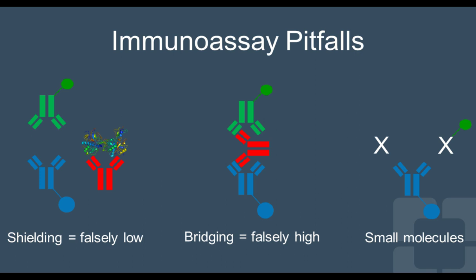Some of the pitfalls for this is that since it only has one epitope recognition site, the specificity of the antibody can suffer due to just the size of the molecule, causing potentially low or unable to reach low levels of sensitivity for measurement or getting many false results.